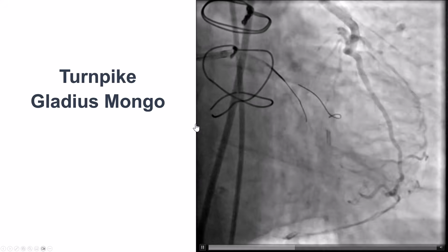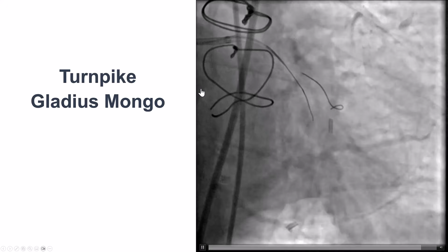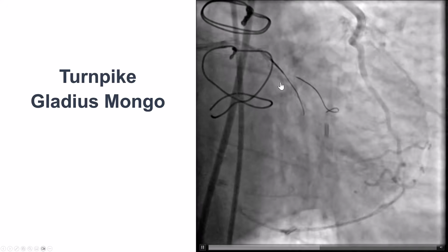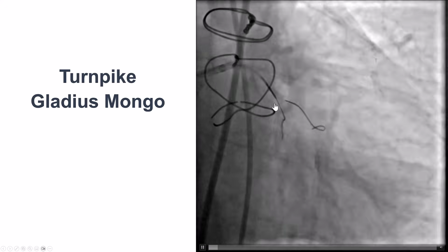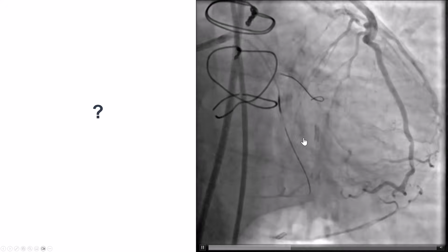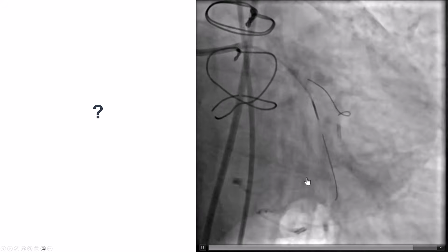However, those two Concerto coils were enough to cause hemostasis, so we left it there and then proceeded with antegrade wiring through the proximal cap. We used a microcatheter, a polymer jacketed guide wire, but the wire did not go into the vessel. Looks like not to be in the same plane as the vessel.